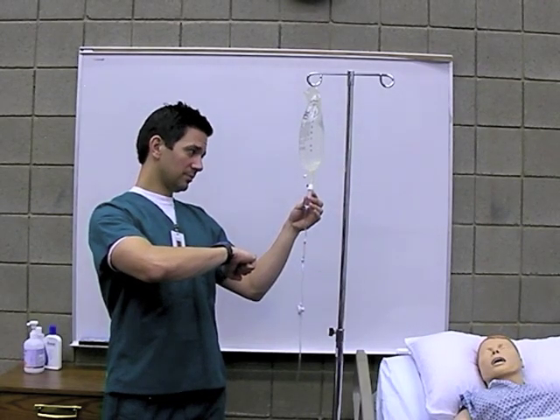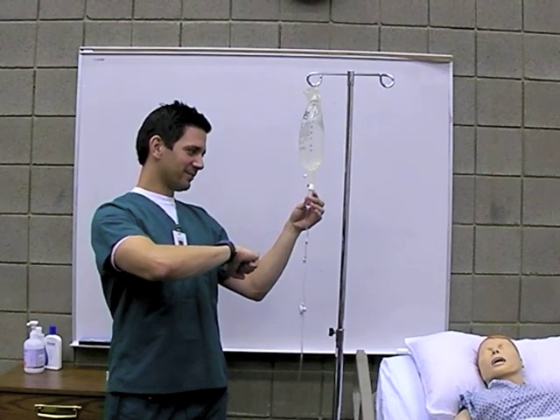Counting the rate can be achieved by counting drops for 15 seconds and multiplying by 4.